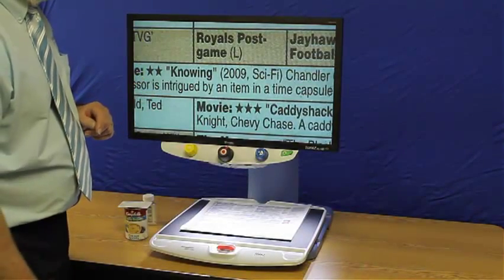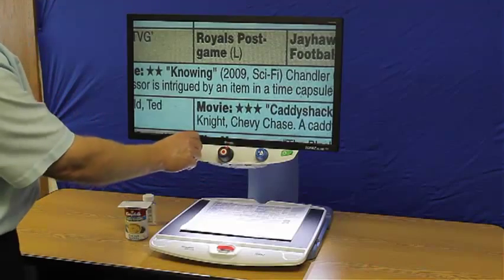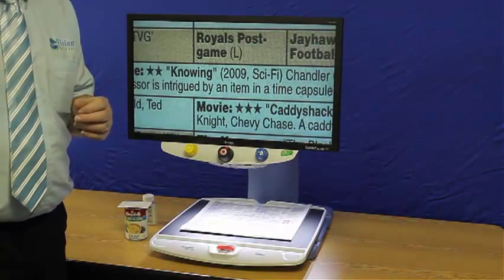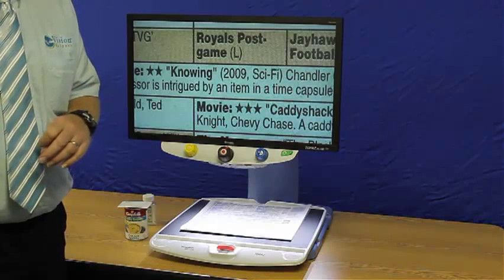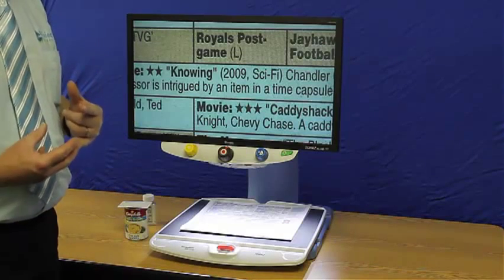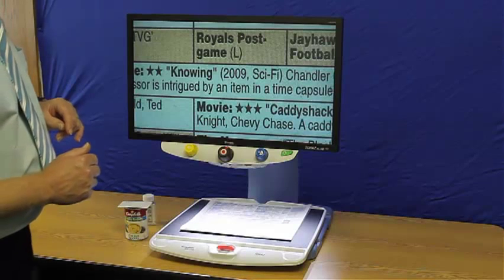So that's really nice. The knob on the far left is the contrast. And by turning it, we can adjust the contrast of it to make it look better. And that's very important, especially if you're looking at something, say, written in pencil. That can make a big difference in seeing what it says. Now that is the basic functions, what you're going to be using the most. There are a lot of other functions. I'll go into those quickly right now.